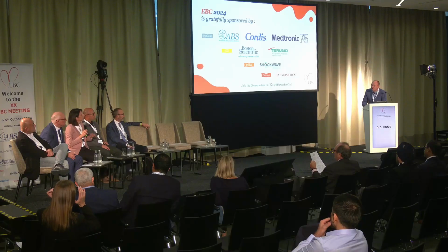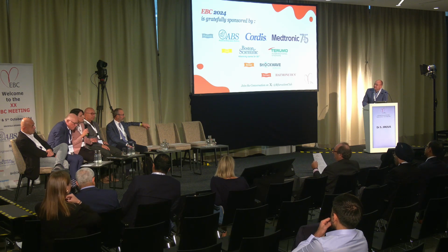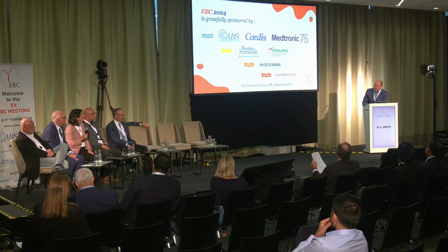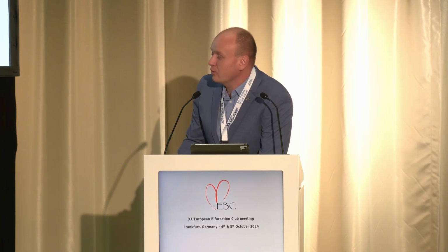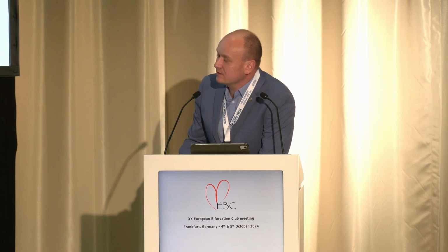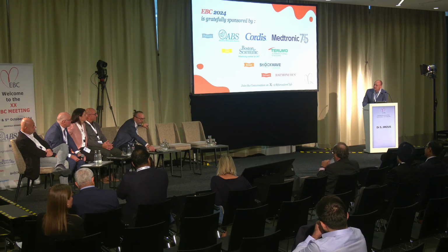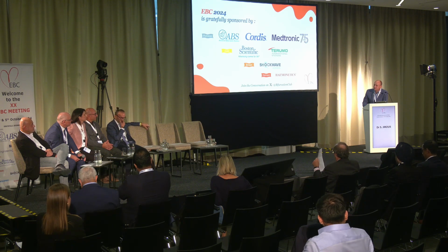To be absolutely honest, especially as you have Impella CP support in this case, it was the second very expensive case for our quite small cath lab. We used 2 Impellas, we used Shockwave in quite an old man, and to take another expensive method like OCT, we considered it. And then we decided not to use it, and that was one of the reasons. The second was his chronic kidney disease, and we tried to use as little contrast as possible.